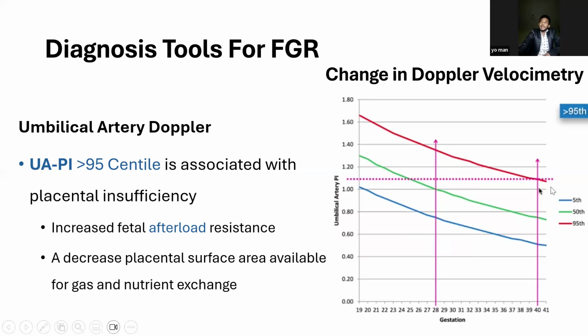So you can see that there is a 95th percentile; the lowest 95th percentile is indicated at 40 weeks gestational age. This is the exact gestational age that must be established before doing anything. If you take this line, the lowest PI value is around 1.1.